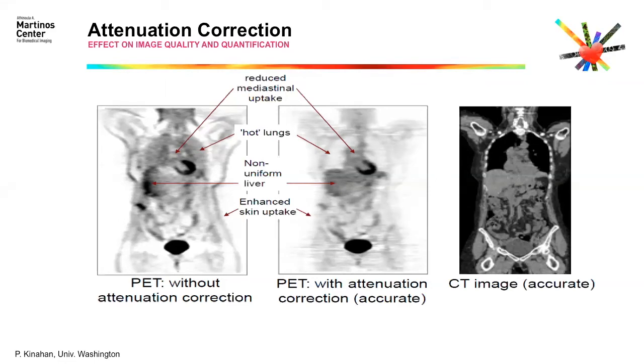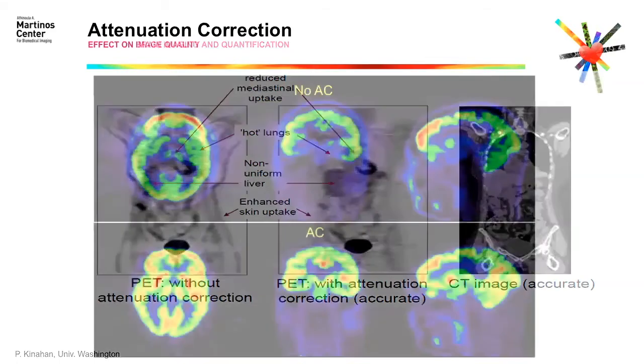So to correct, again, we were saying that we need electron-based density. CT X-rays are electron-based density images. So we can use a CT image for attenuation correction and then for scatter, because we can use that information to simulate what the scatter was. So this is one of the reasons why PET and CT can pair together. And there's another reason that I will tell you in a second.